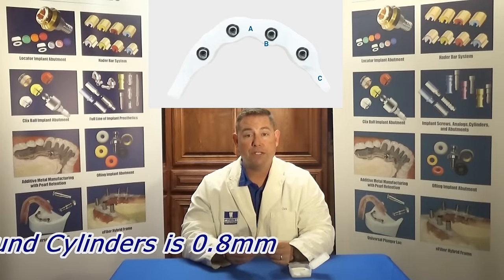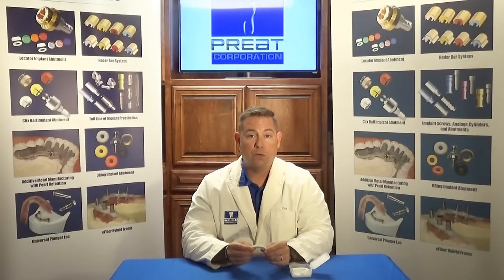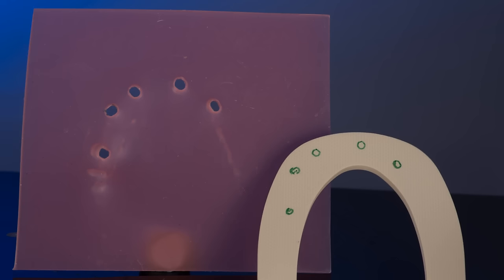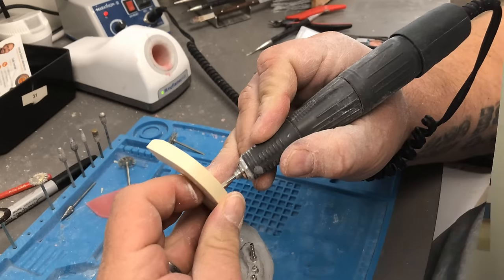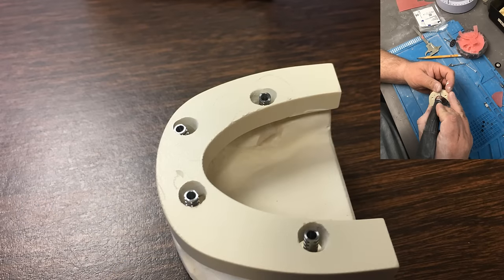Outside of that, you can design your implant framework as thin, as thick, or any size you want. First, you'll take your verified cast with your temporary cylinders in place, take a sheet of wax, and mark where the cylinders are. You'll transfer this over to the Trilor arch, mark on the arch, and take a small pilot diamond to put pilot holes into the Trilor arch. We've had great success using the Comet number 4 round burrs to open up 4 millimeter diameter holes to receive our temp cylinders.